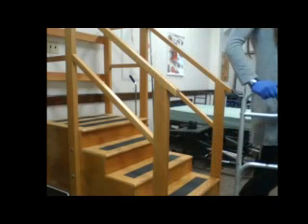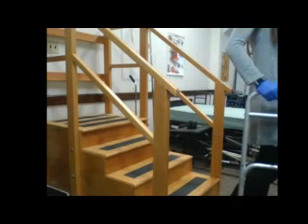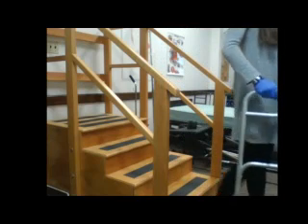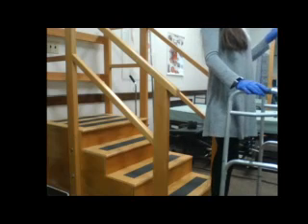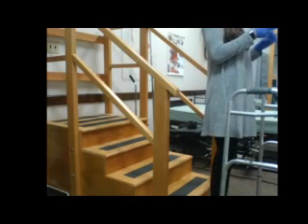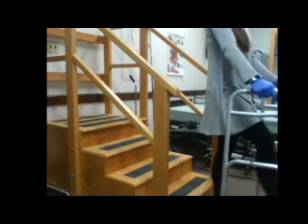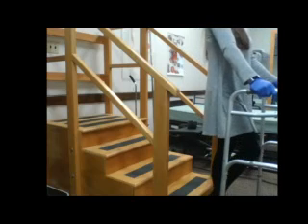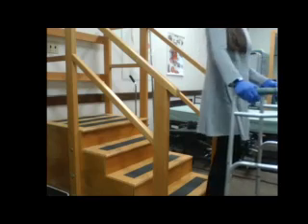However, I will show you a trick for using a walker. This trick only works in a couple scenarios. If somebody has another individual at home to move the walker around for them while they're on the stairs, or if they have a separate walker that they can leave set up for stairs. So let's say I fractured my foot and I needed to go up the stairs and I was using a walker, or I was non-weight bearing for some reason, maybe I fractured my hip or something.